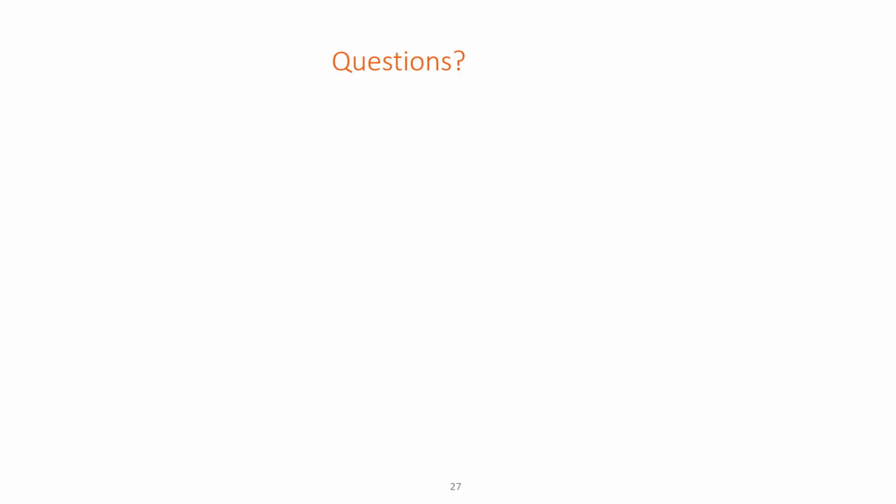I have another one, and this will be the last one, Maggie. Hi, congratulations. It was a very nice presentation. I have experience with VHIT in the emergency department. I use it for the differentiation of benign and dangerous conditions when the patient has acute vestibular syndrome. I find it very useful.